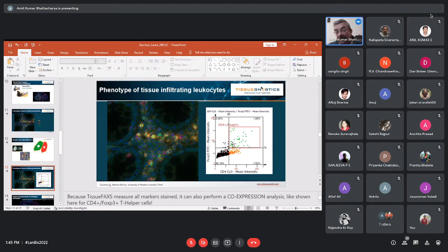And all the cells in this box are marked by this red boundary. What we have done is gated this population, and we see the gated populations marked by cells having red boundaries, and each of these cells with the red boundary has both CD4 and FOXP3 in it. Now we also see that some of these cells are yellowing. CD4 is stained with a red dye, and FOXP3 is stained with a green dye. If green and red are present in more or less equal proportions, we see a marked clear yellowing. Otherwise, it's also a yellowing, but a different shade of yellow.